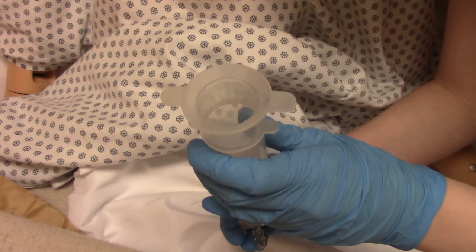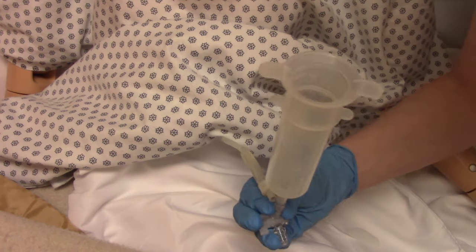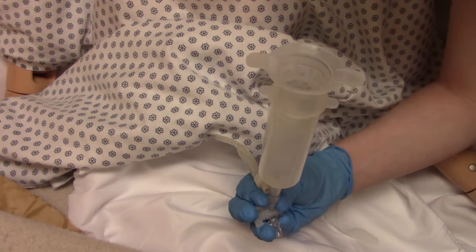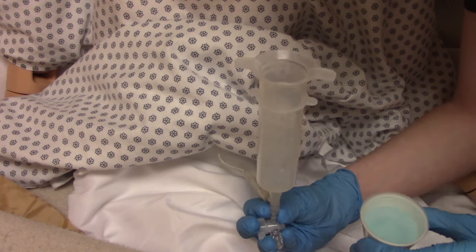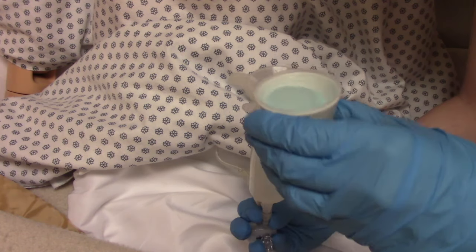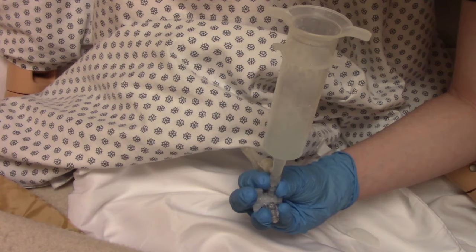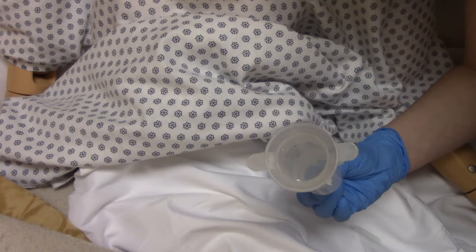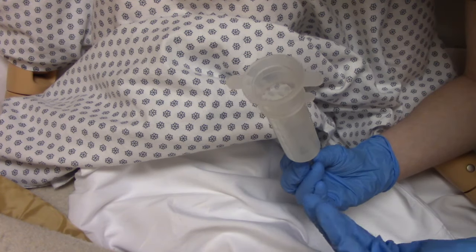Now we're ready to give the medication to the patient. Put the syringe back in the port and turn the valve so it's open. Just as you would with any medication, explain it to the patient — for example, 'Mr. Johnson, this is your blood pressure medication, do you have any questions?' — then administer it.